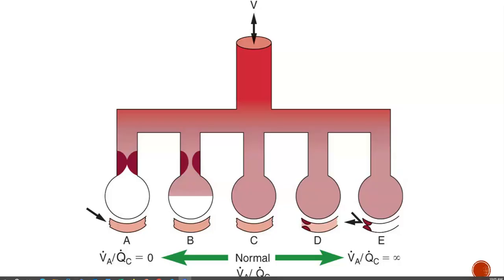If we drop it into one of those main stems, we can very easily have problems. We can give too much pressure to one lung and cause a pneumo, and we can not adequately oxygenate the other lung, and that becomes an issue. A lot of things can arise from not being able to adequately perfuse and oxygenate.